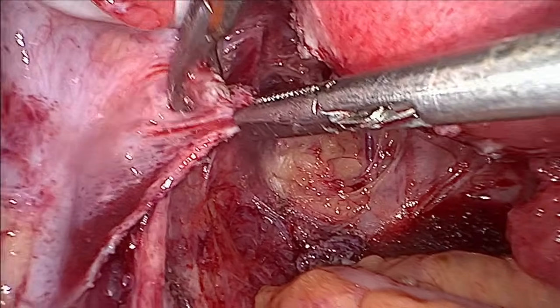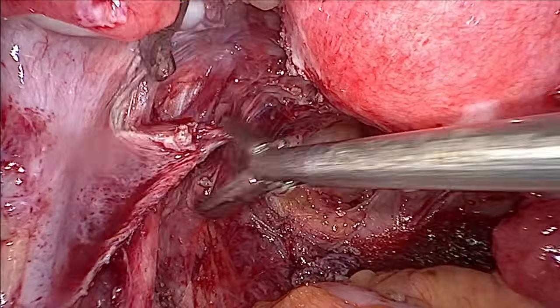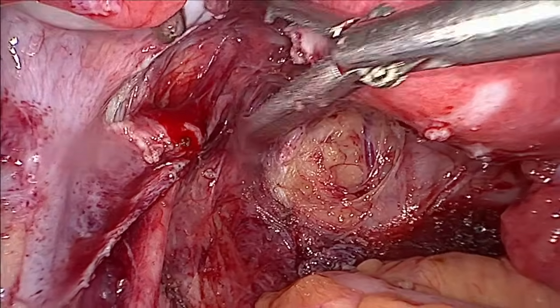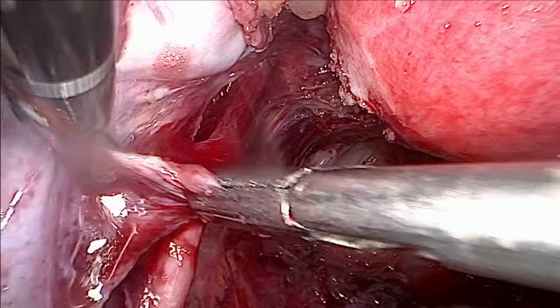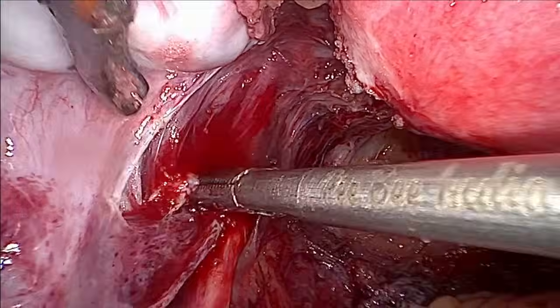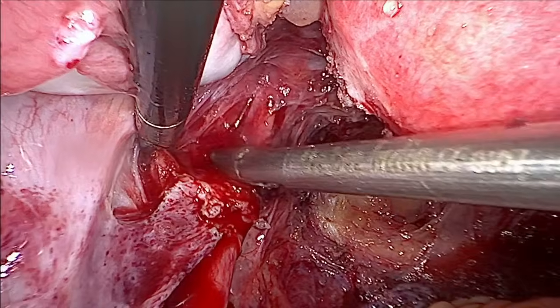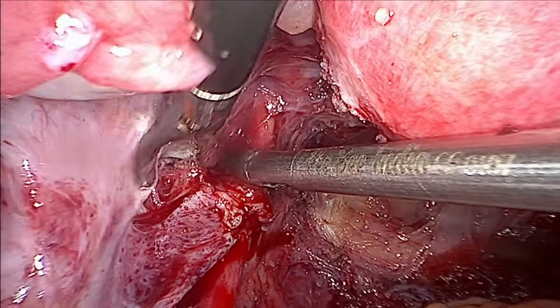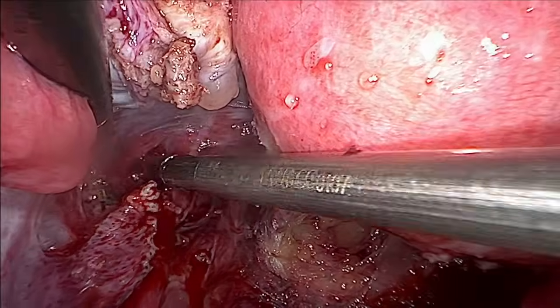And you can release the ovary from this peritoneum here. This is the uterine branch here.